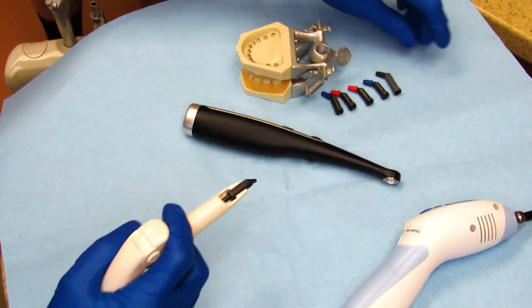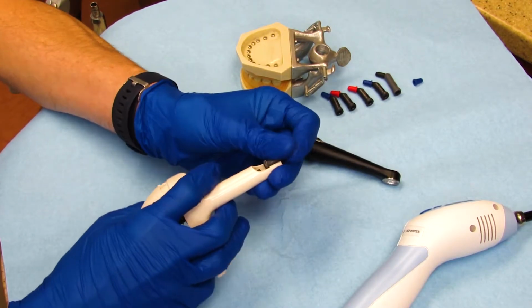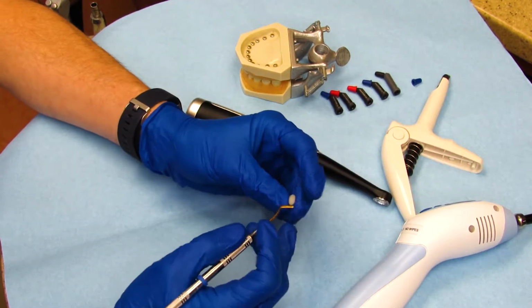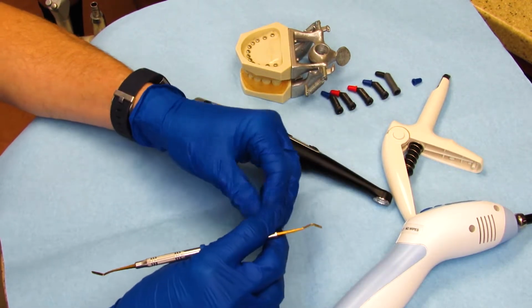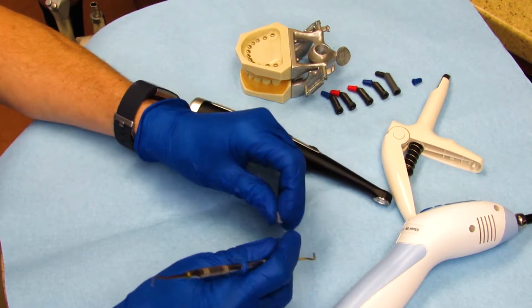We make fillings. This is a filling material. Comes in these little tubes. Fillings, after we've removed the cavity, they come out in these little raindrop tear things. And it's a very putty-like material, so we can adapt it and shape it into various different things. And what I'm going to try to do right here is I'm going to try to make a tooth.